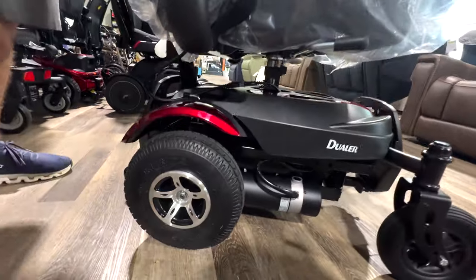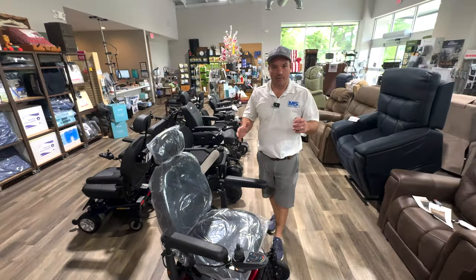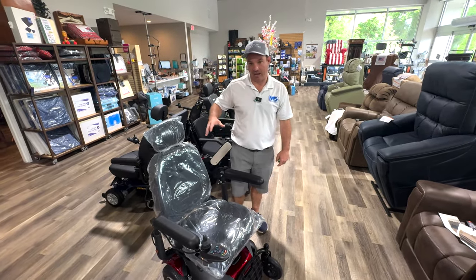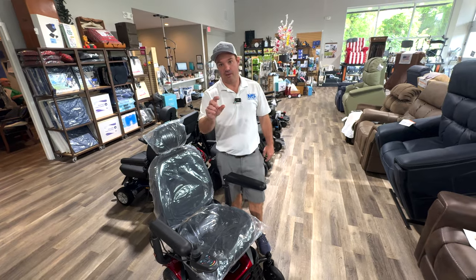Right now this is back wheel drive. Power chairs come in back wheel drive, center wheel, or front wheel, and they each have a purpose. Center wheels have tighter turning, back wheels are a little bit better outside, and front wheels offer extreme tight turning — so maybe better for getting over a threshold.